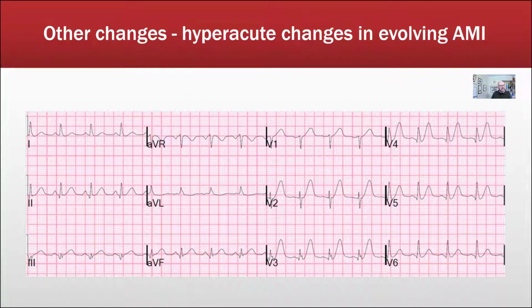So before we go on and practice the skills associated with finding ST segment elevation, there are a few more pointers we should go through that are going to help with the ECG diagnosis of either a STEMI or a non-STEMI overall.